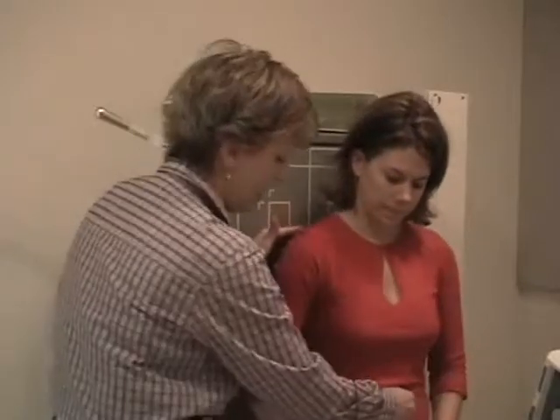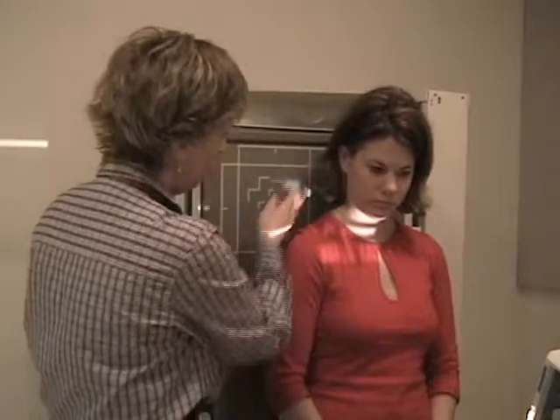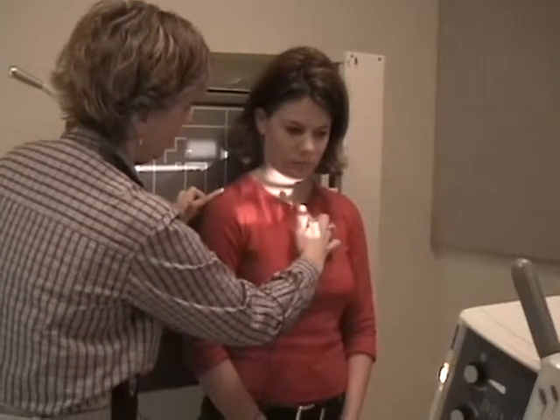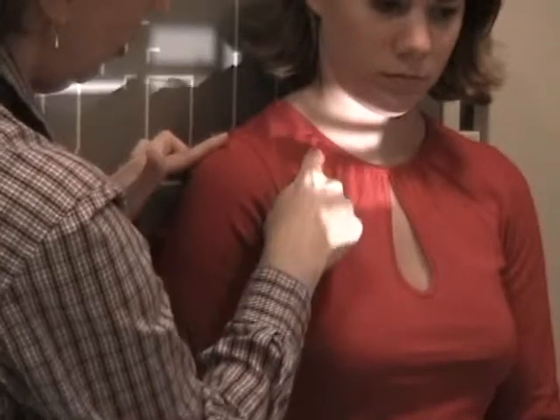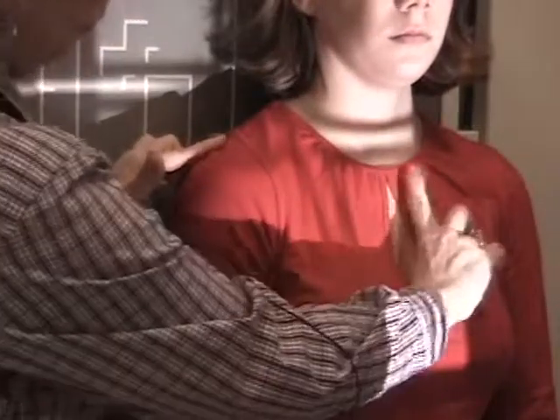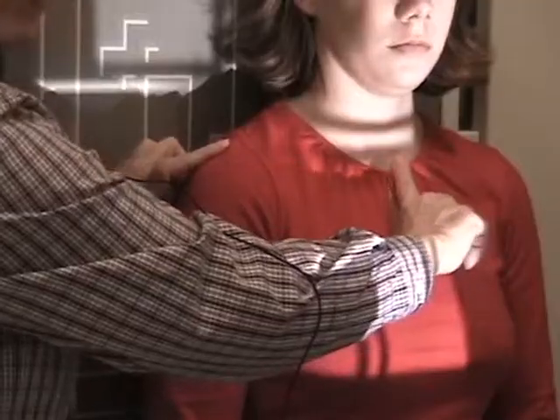My patient stands, her feet separated. And remember, the tube is transversely centered. You have the sternoclavicular joint and you have the AC joint. Those are the two boundaries of the clavicle. This crosshair, and I'll open the collimator so you can see better, is going to be into the center of those two points. So I'm going to step in front of the camera so I can get a good look to see if she is centered here.